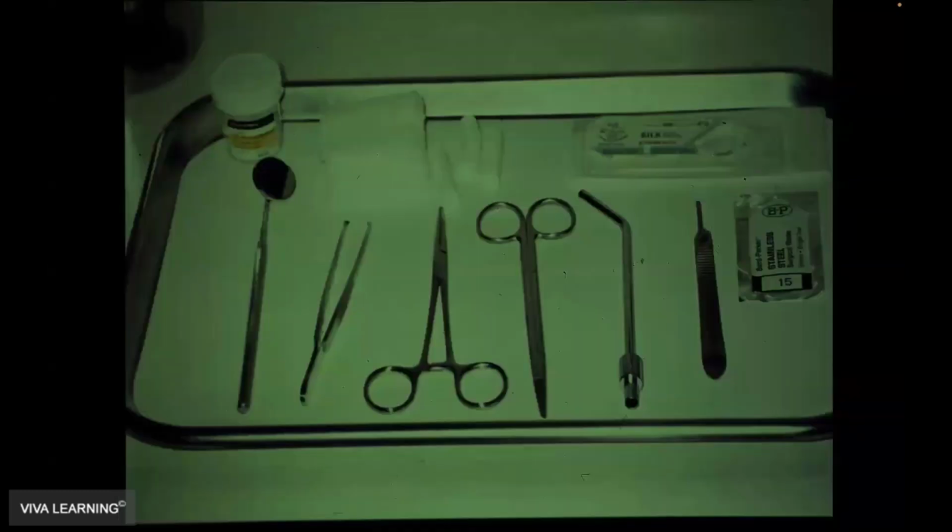So this is what it looks like. We have the mirror. Instead of cotton pliers, I have something called Adson forceps, A-D-S-O-N forceps. They're a little fancier than cotton pliers. Needle holder, scissors to cut the suture material, suction tip, 15 blade and handle, suture material of choice, cotton roll, gauze, and the biopsy jar. The biopsy jar is supplied by the oral pathologist.